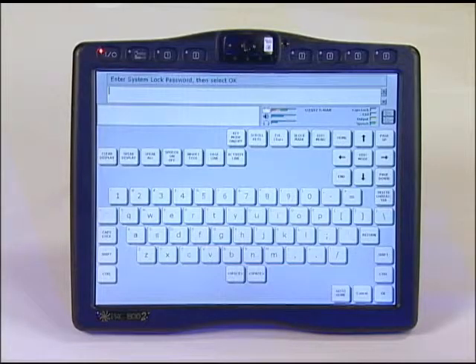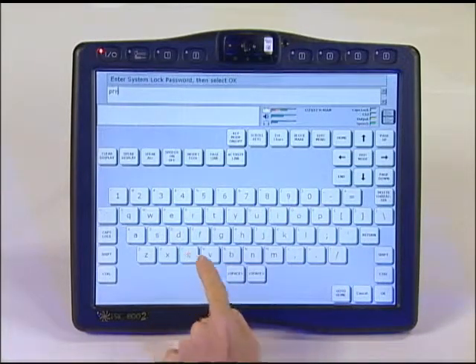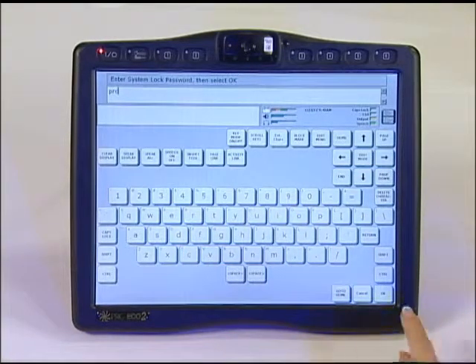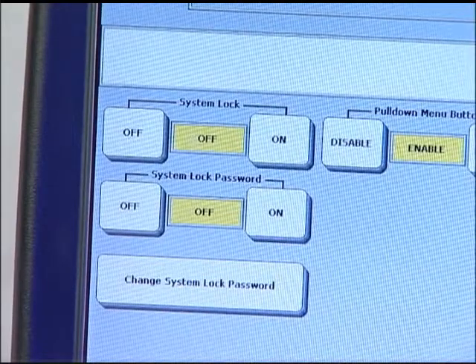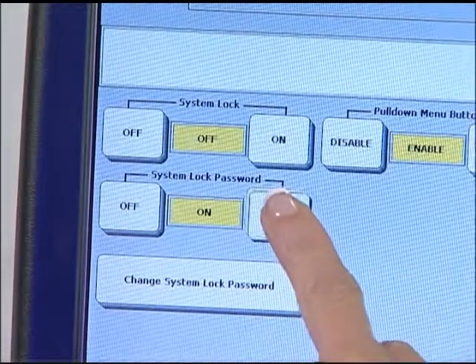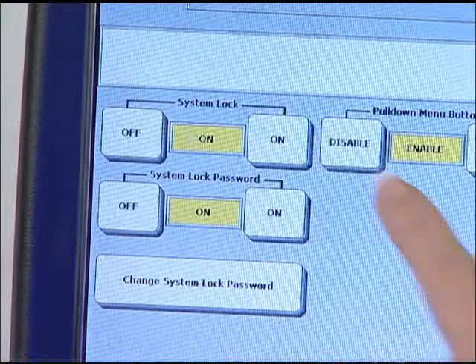Type in your desired password. In this example, I will type PRC as the password. Then select OK in the bottom right hand corner of the screen. Set the system lock password to ON by touching the ON key.